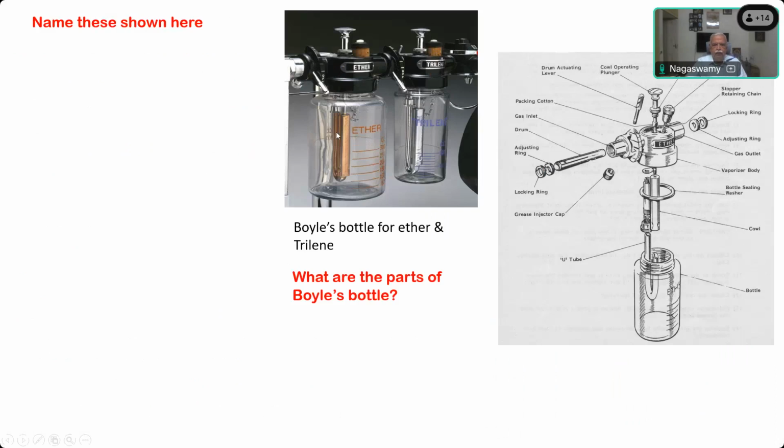What will happen if you push the plunger? When you lift the lever to 1 or 2 position, only part of the gases will come, because it's a variable bypass. Not all the flow coming from the flow meter will enter, only part of it. Instead of keeping this plunger fully out, if you press it, the gases will enter through the gap between the plunger and this copper tube that you are seeing, and there will be a lot of holes here.